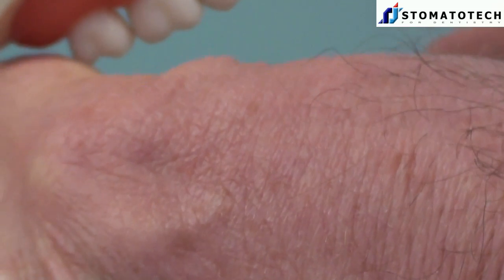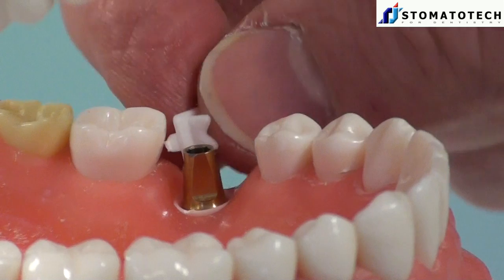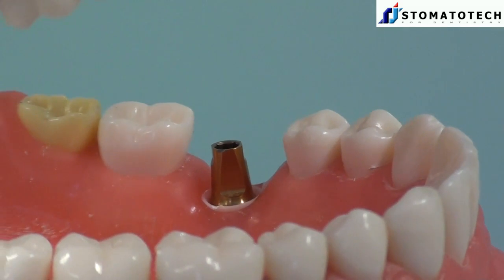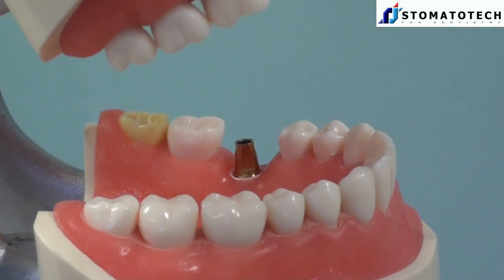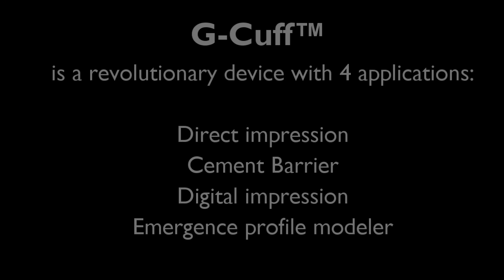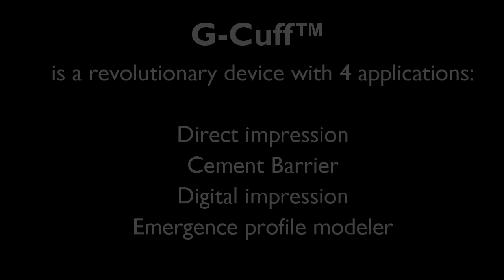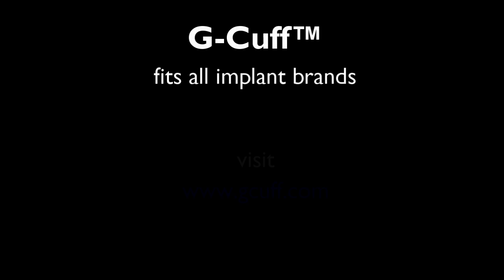Now I remove the tabs and the G-Cuff is in place with the abutment. It's very easy and very useful. Thank you.